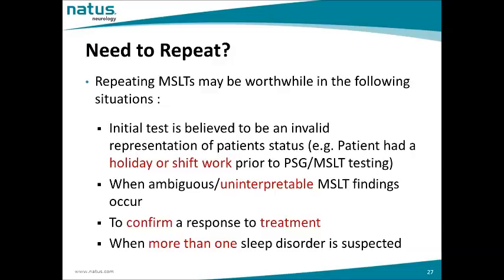Do we need to repeat an MSLT study? It will be worthwhile in the following situations: when the initial test is believed to be an invalid representation of patient status, for example, maybe they had a holiday or shift work prior to PSG MSLT testing; when ambiguous or uninterpretable MSLT findings occur; to confirm a response to treatment; or when more than one sleep disorder is suspected.